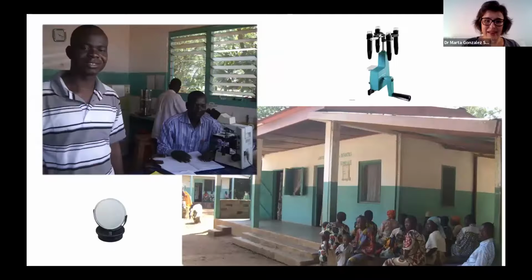So let's go in. On the bottom right, you'll see a typical district hospital in Africa, where you have the OPD, which is actually antenatal care, and all the mums waiting to be seen. At the end of the picture, you can see a door that leads into the lab. On the top left, you've got the lab, and you can see several things: a microscope, hooray, a water filter, that metallic cylinder at the back, and a fridge. So we're not doing very badly.